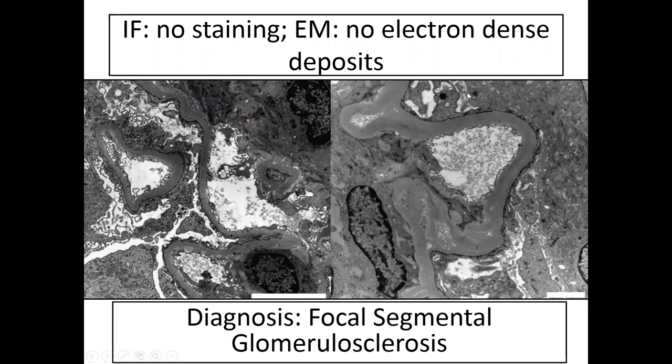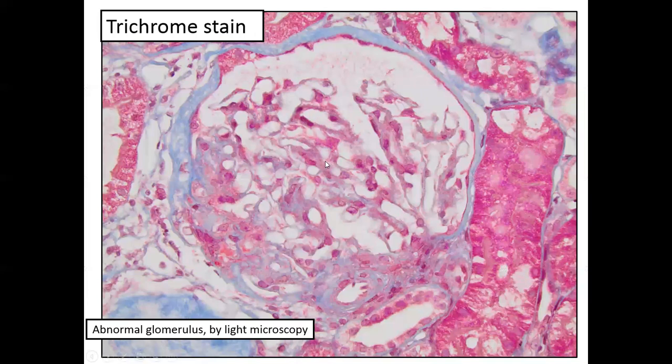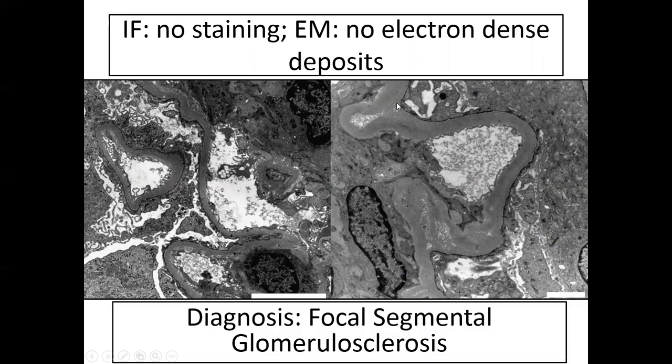So this is a situation where we really had to, based on this, say, I see a lesion, I see tiny irregularities in the glomerular basement membrane. This is probably an area that was a thickened capillary wall to match my thickened capillary wall out here. But I don't know why. Hopefully, once we identify a great subset of these cases and we have pedigrees and we do GWAS, we can find causes of this podocyte injury.